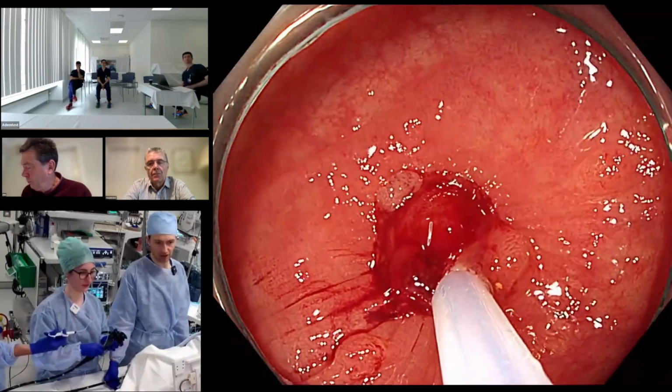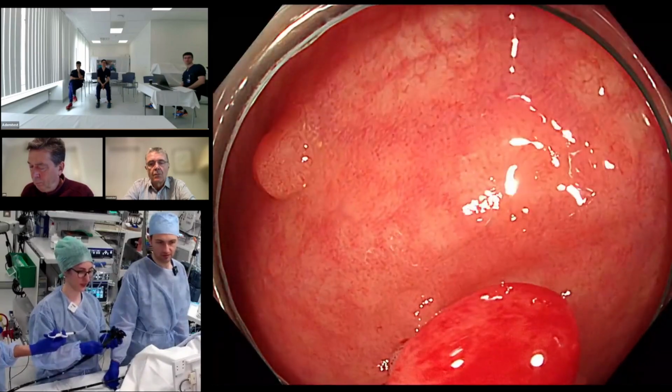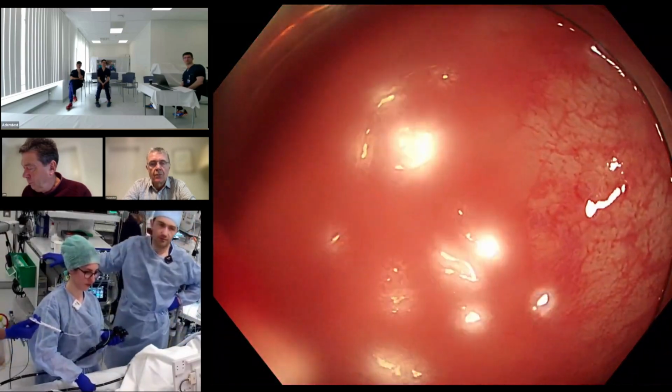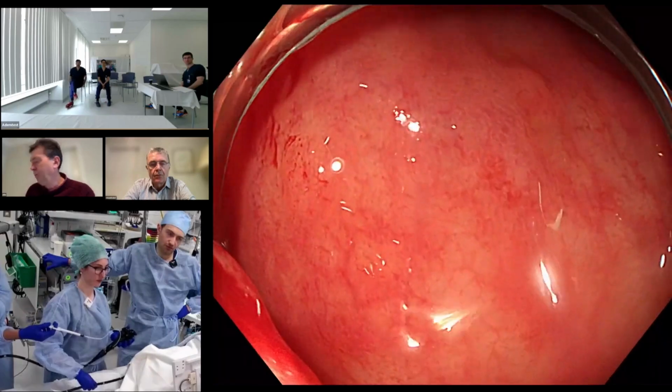Okay, so now you saw all the margins come in. We have a bigger piece of tissue. All right. So now you can cut. Okay, and now I'll let you have it. So you removed it. Okay, great. You did it probably with best practice technique.